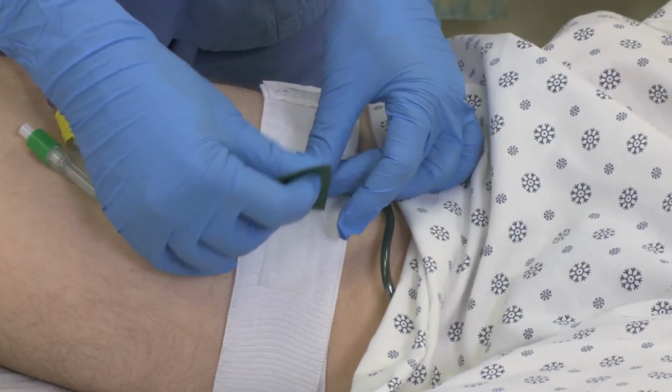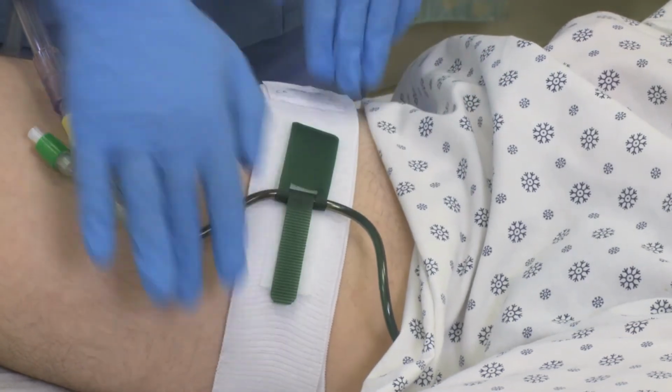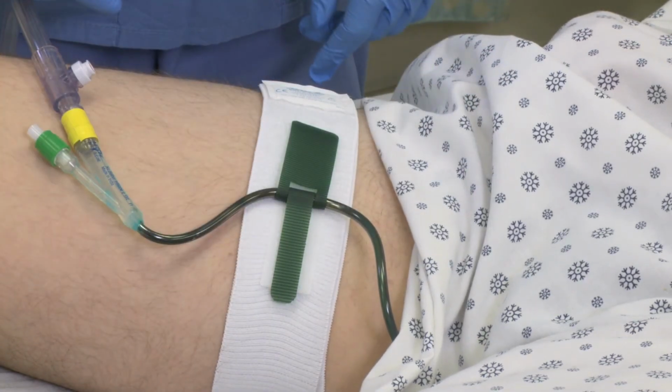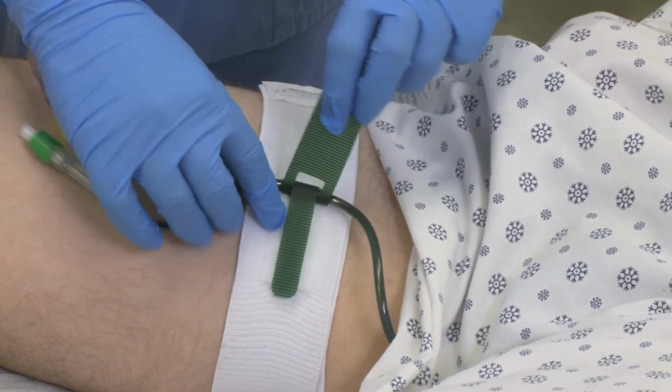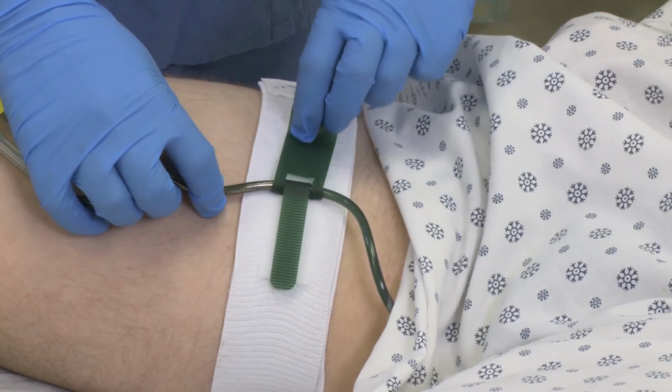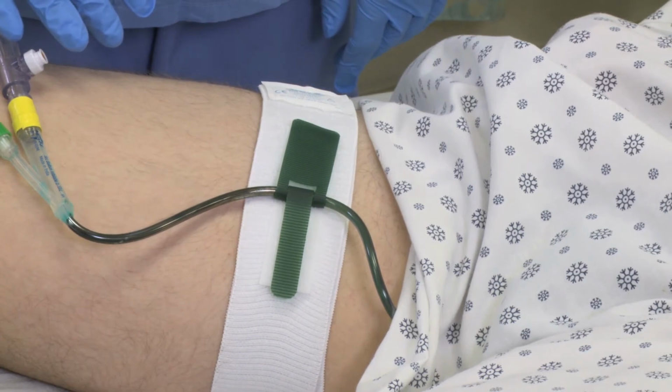Alternately, you may secure at the drainage tubing or the catheter itself. Leave an ample loop in the catheter above the leg band to avoid bladder traction. To reposition the catheter, raise either of the green locking tabs, adjust the catheter, and refasten. Make sure the catheter is not occluded.